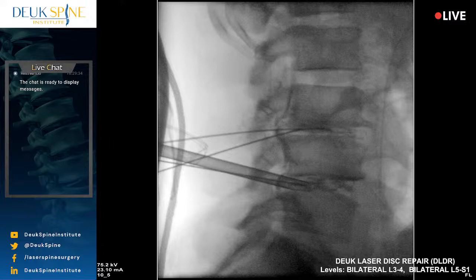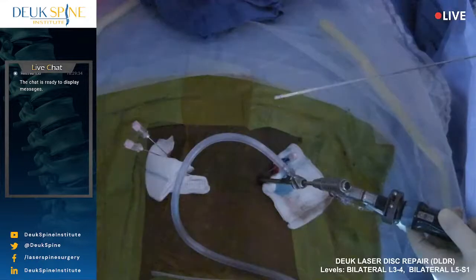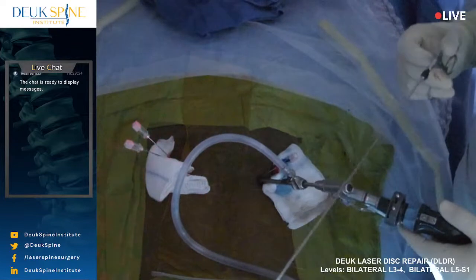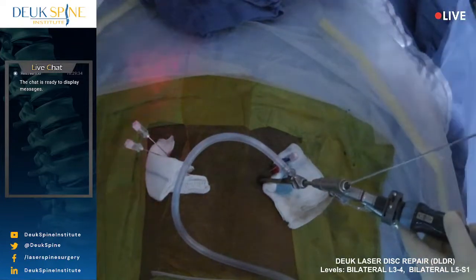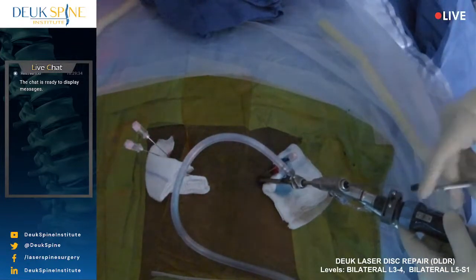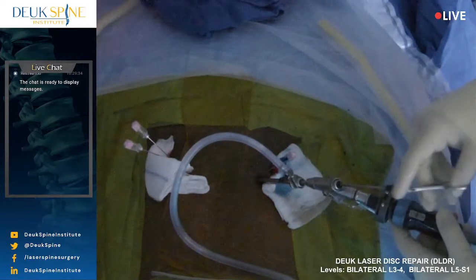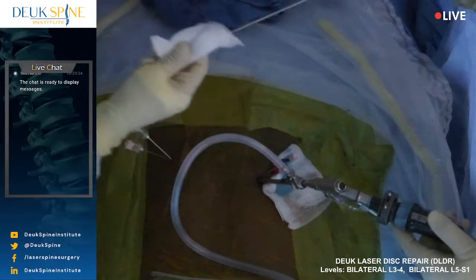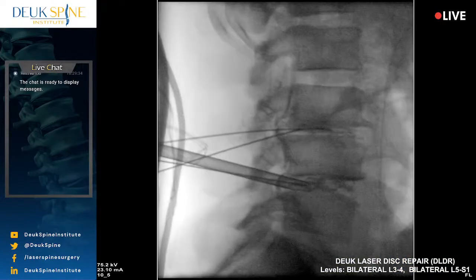Oral lasts longer. Scope on. But ultimately, whatever you feel comfortable with. Come on, guys. I need to see what I'm doing. Right there. Come on, guys. We really need it. I can't see there. Can't see behind me. I need the scope up top, guys. Thank you. Laser.